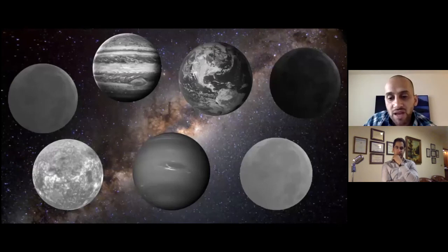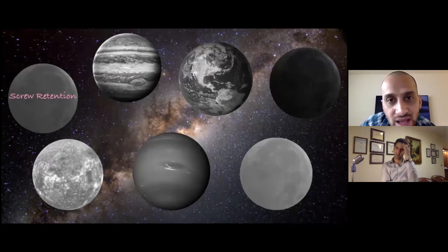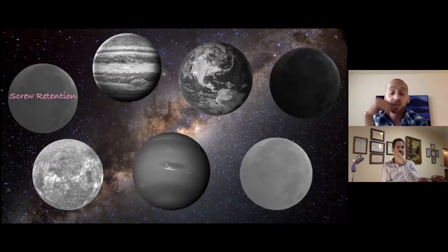So let me just finish up this presentation by giving you an example of how we can do that. Before I show this case, I'd like to say that this is an external hex implant, and it was restored with a prefabricated zirconia abutment. These abutments are available for the external hex, and I recommend them significantly for the external hex. For the internal hex, I'm not sure if that would apply.